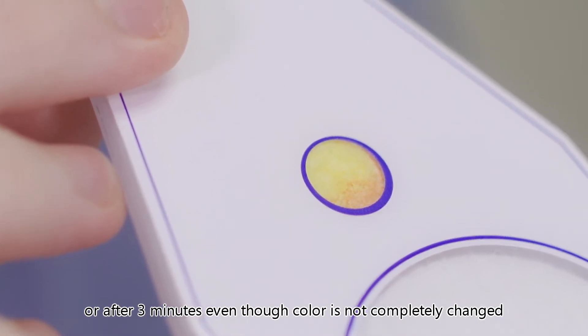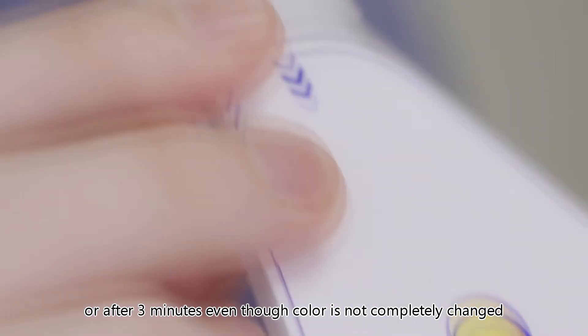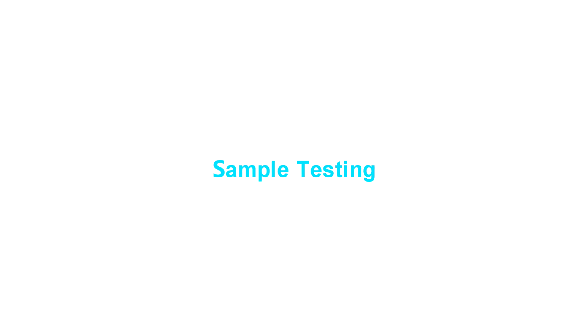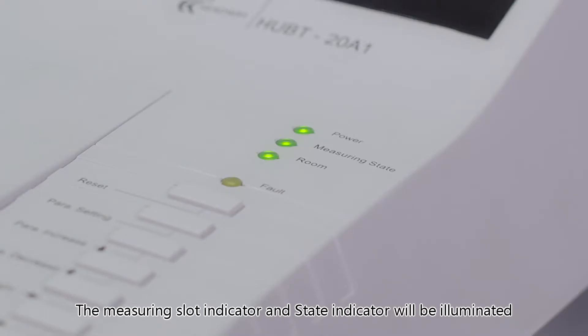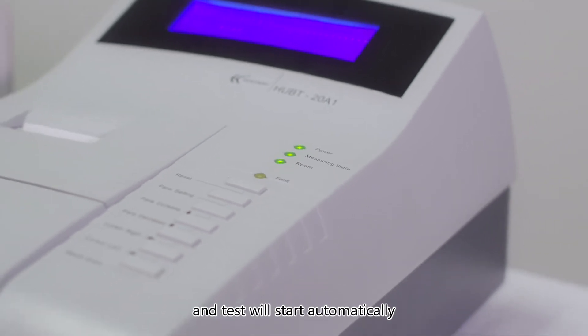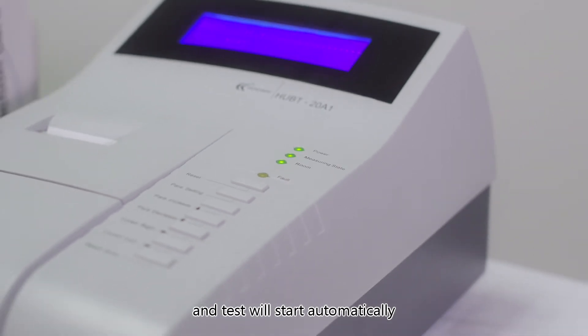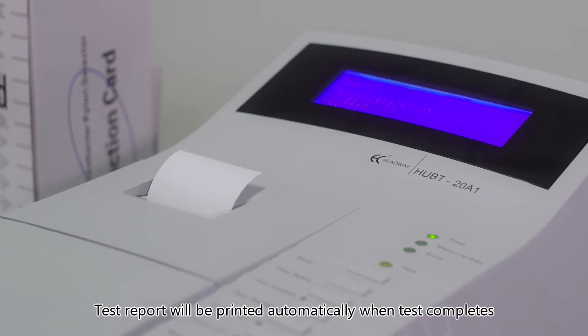Sample testing: Insert the sample card into the measuring slot. The measuring slot indicator and state indicator will be illuminated and the test will start automatically. Test reports will be printed automatically when the test completes.